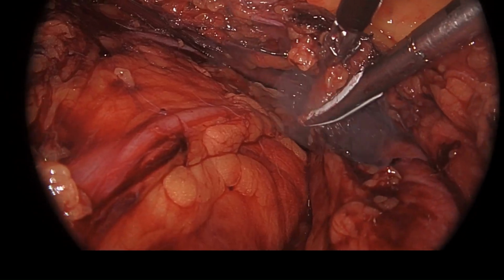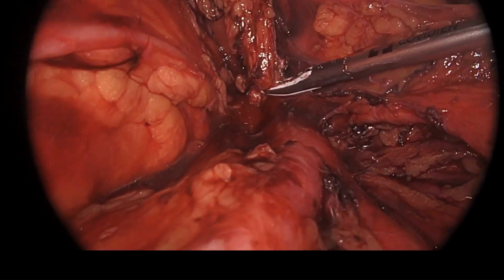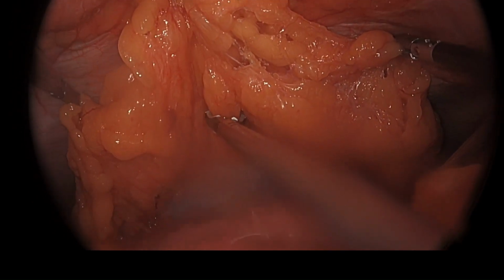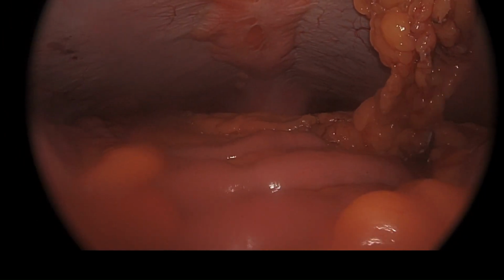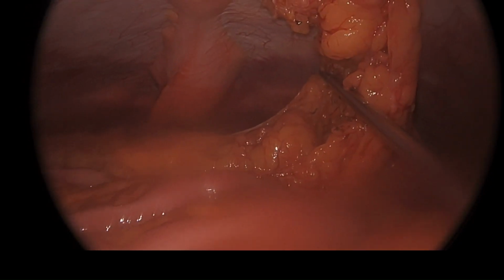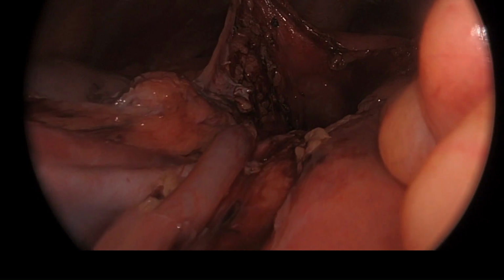For en-bloc harvesting of paraaortic lymph nodes, all areas were created, and then paraaortic lymph nodes were harvested. Finally, omentectomy was performed by separating the omentum leaf from the transverse colon and dissecting the subgastric part. After the omentectomy was completed, it was removed from the body through the vagina. The final image shows the inside of the abdomen after the procedure.